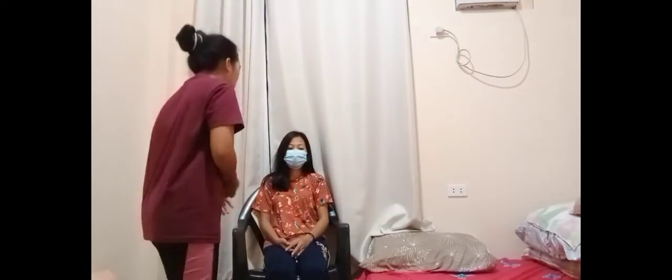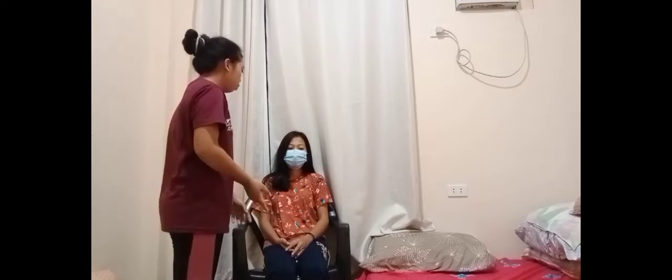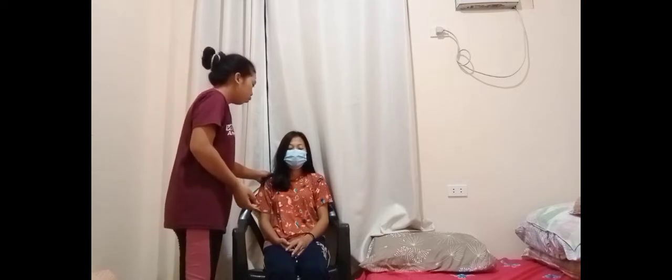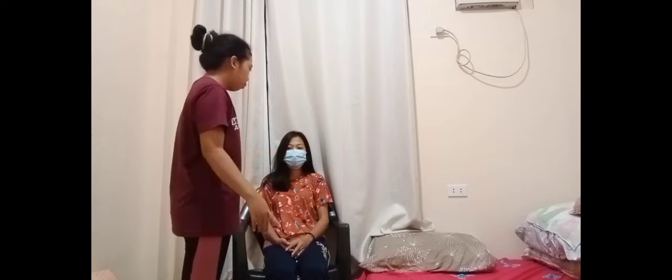In moving from chair to bed, make sure that the person's strong side is beside the bed and that both feet are flat on the floor. Next, ask the person to move forward in the chair and make sure their feet are under their knees. We're going to move from chair to bed, ma'am. Are you feeling dizzy or in pain? We need to move from chair to bed.